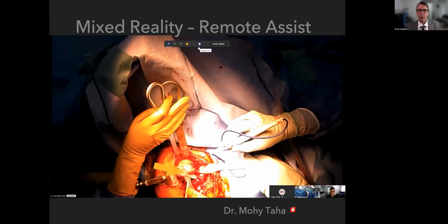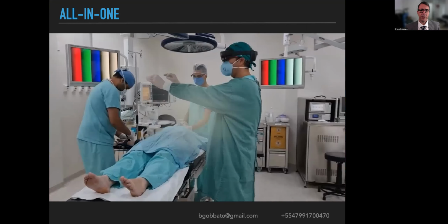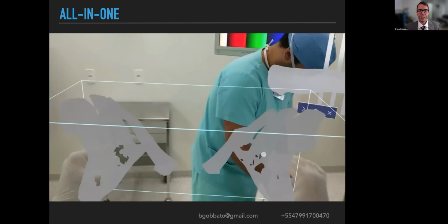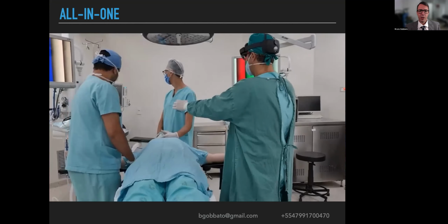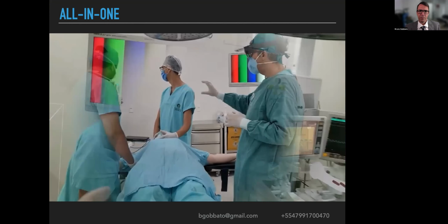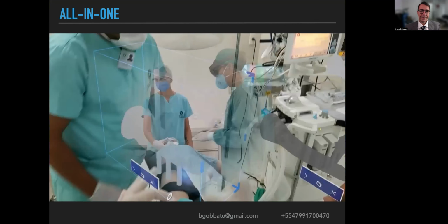And now I'm teaching him how he will perform the humeral cut. This is kind of a proof of concept. And this is how we do it ourselves in the OR. This is a representation of the glasses, how we place the models. We can have different kinds of models for different steps of the surgery and how we manipulate them.